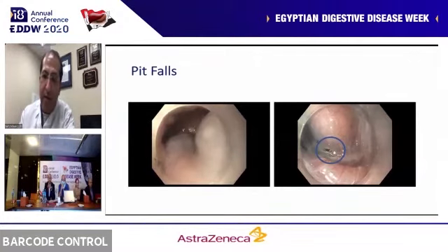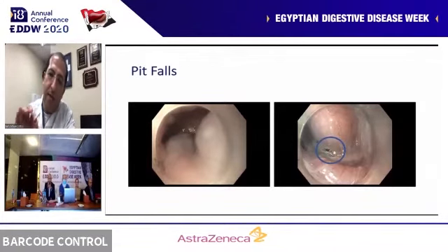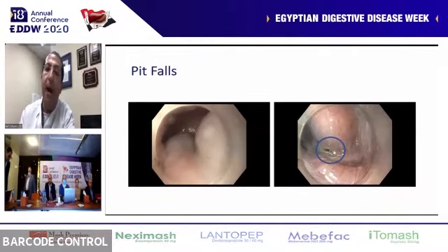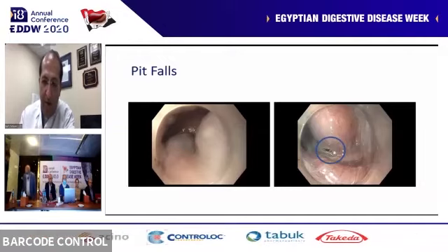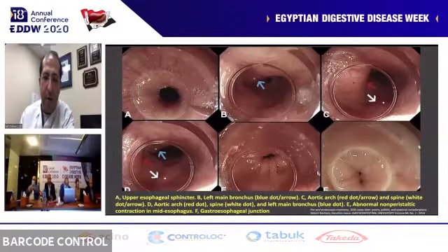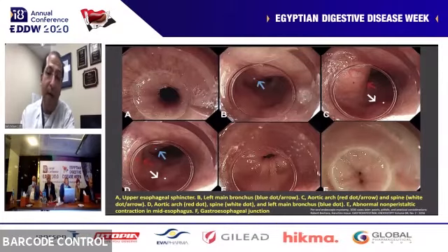In the picture to the right, from that prolapsed mucosa, you can see that there was a small mucosal perforation that has to be addressed after you're done with your POEM. You have to go and find this. Some people would put a wire through to localize it, or go from the outside and close it before they complete their myotomy. But you have to be careful with these things. Again, in the NOTES paper with Bishara that's published in GIE, the references are at the bottom, if you'd like to review it after the lecture.